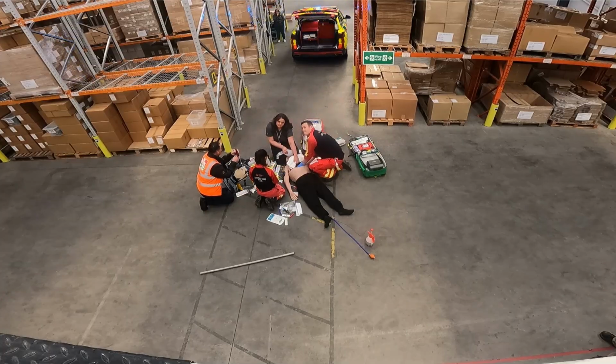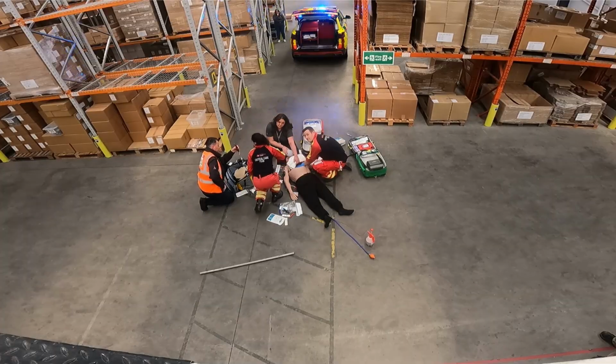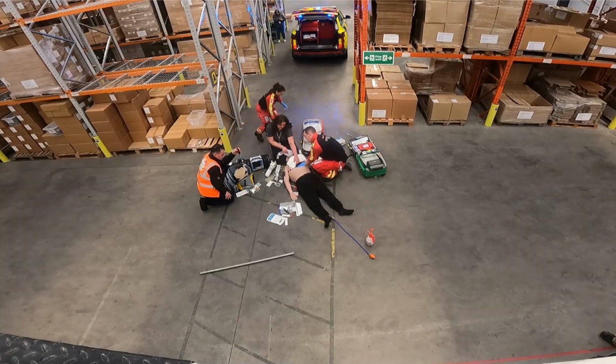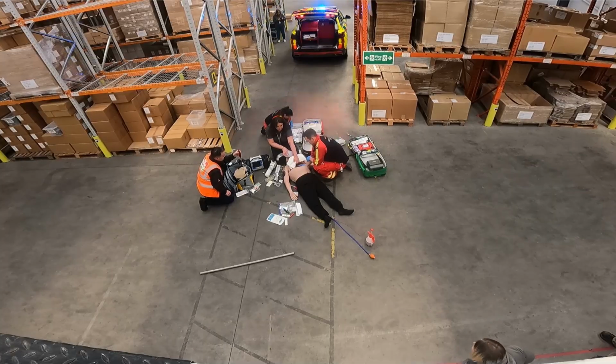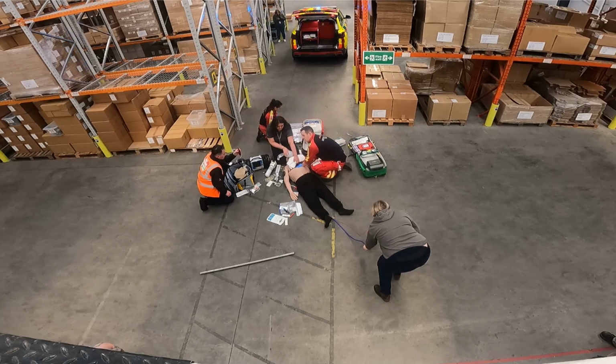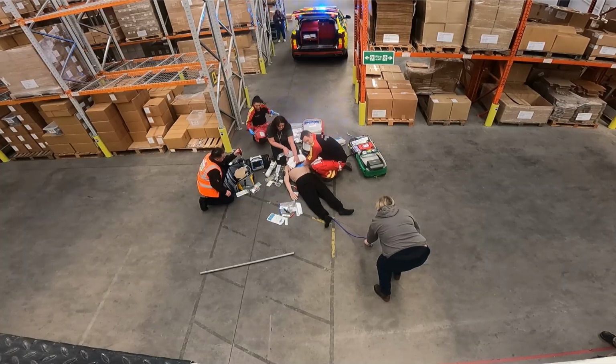So you've got the same as we are at the moment. The heart rate is changing slightly. You can see a change of the end tidal. You can feel some movement of the heart in between your hands. You see some flickering of the heart in between your hands. Continue to support that, making sure there's enough blood flow throughout the body.